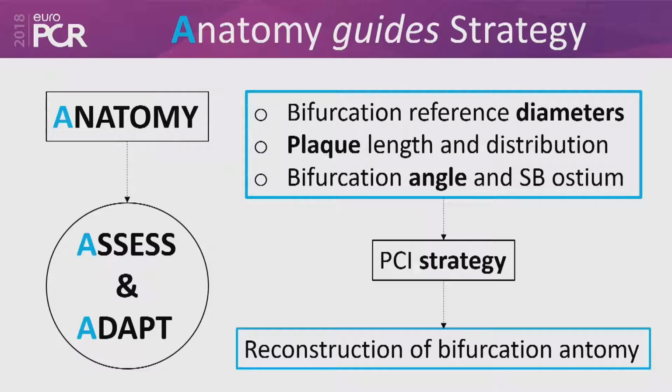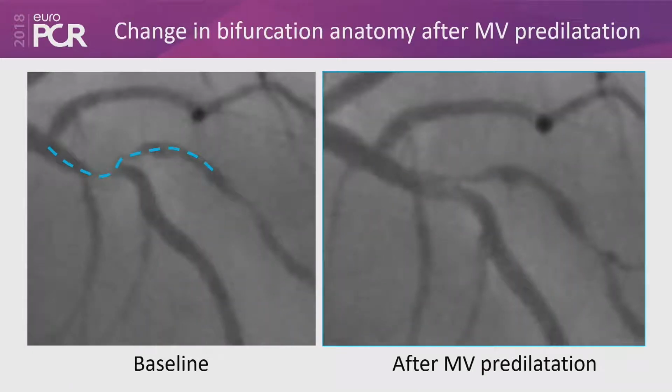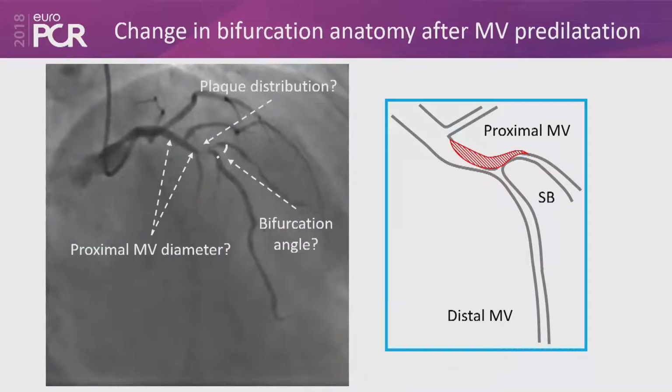Dan, we have one question here. I think it's a rather difficult question, but perhaps could we see the images of the LAD diagonal PCI that you just did? One of the points that you pointed out quite importantly was that, in order to protect the side branch, we at least need to know something about the territory and the importance. But I saw another image in which that diagonal was approximately the size of the catheter, perhaps even smaller.